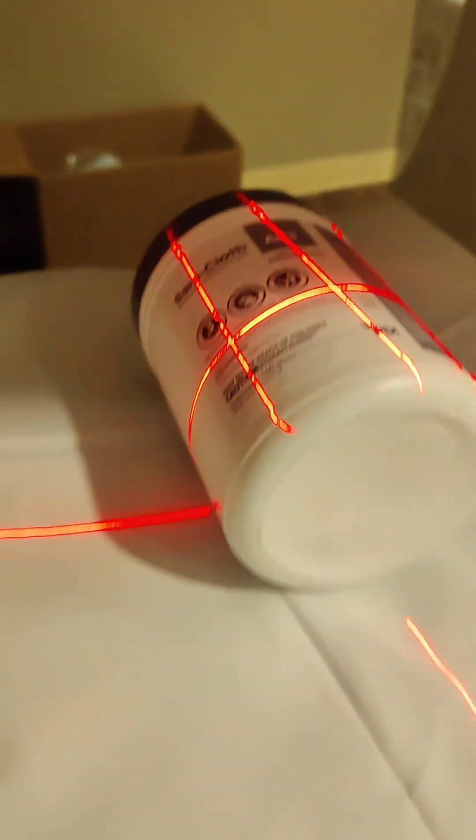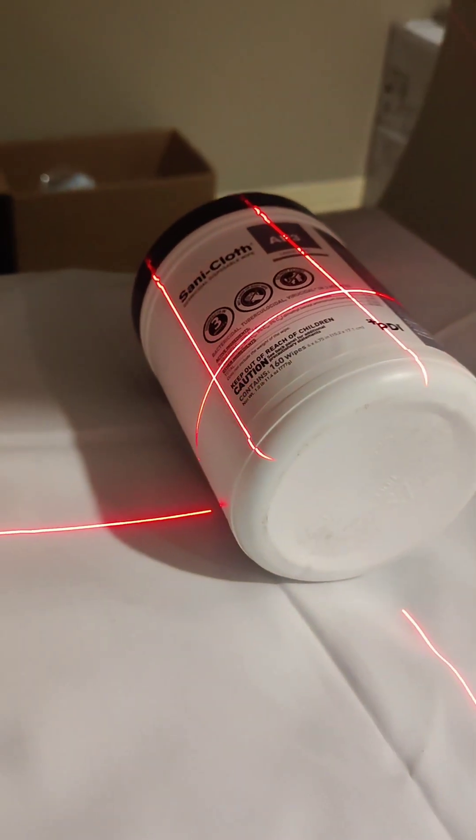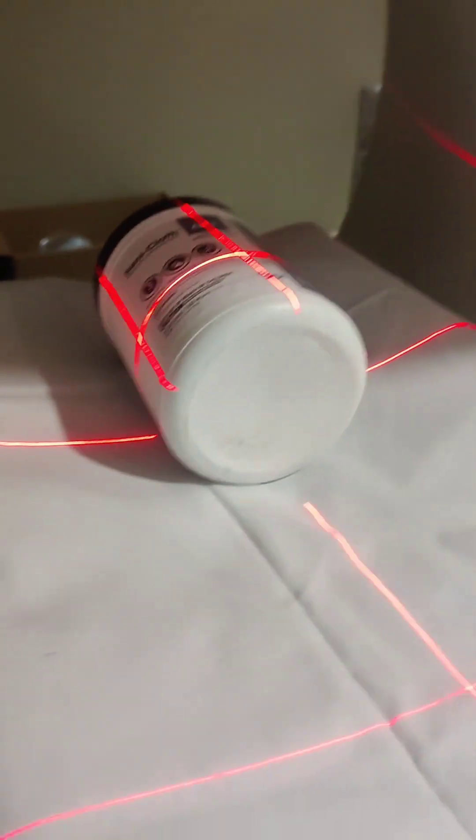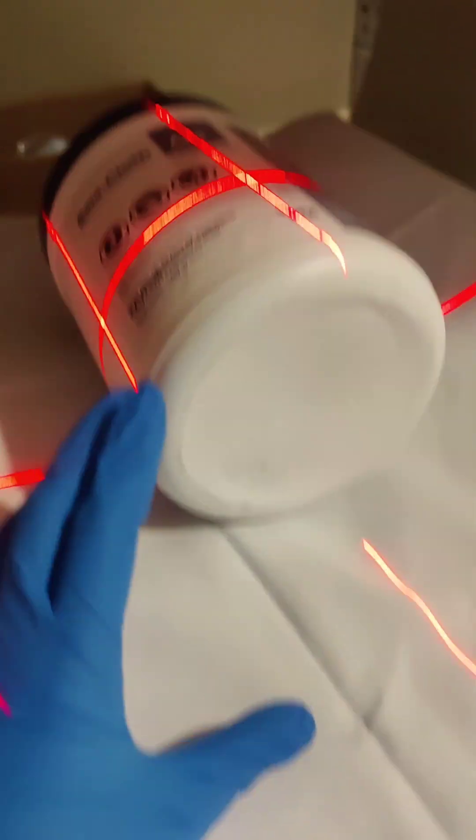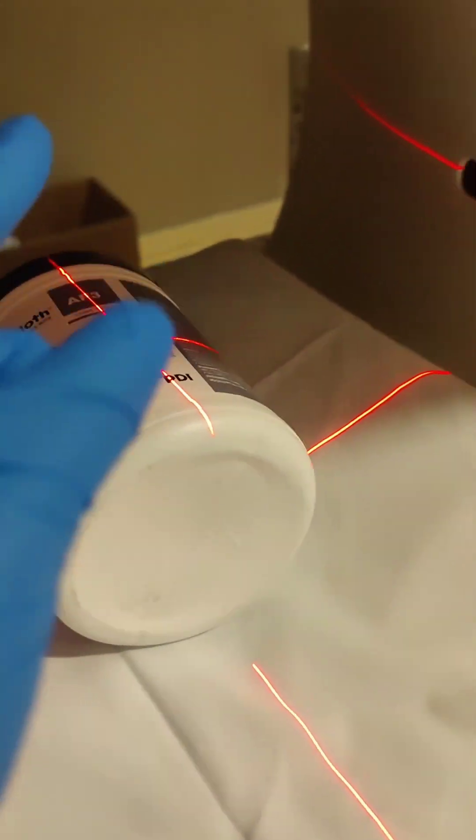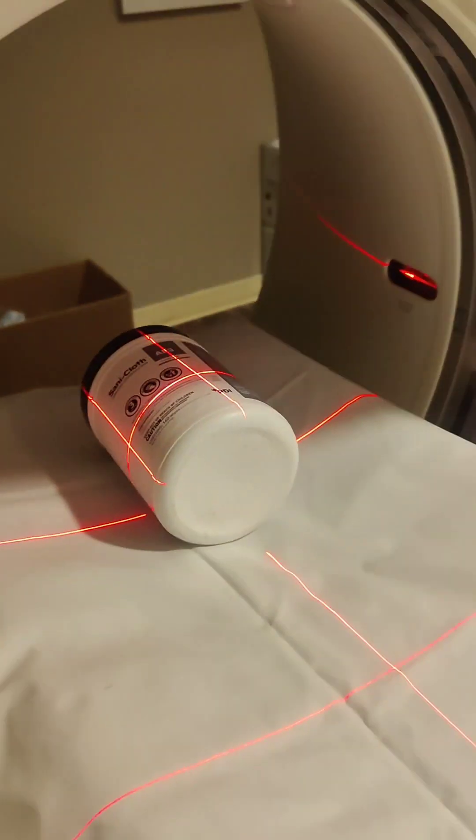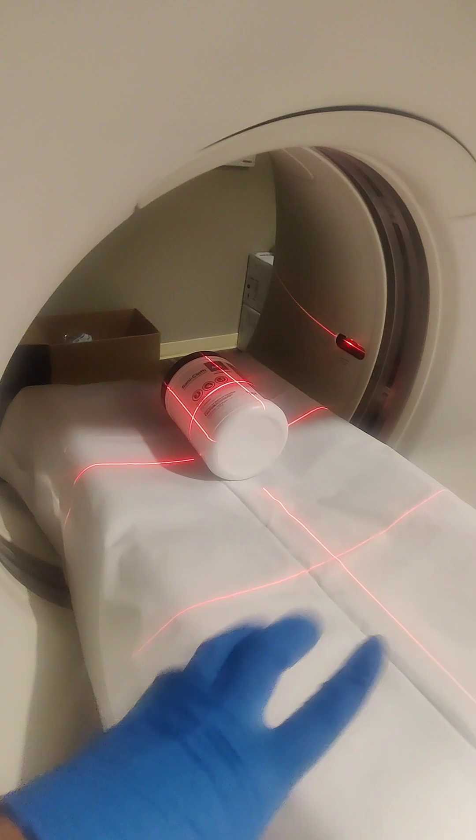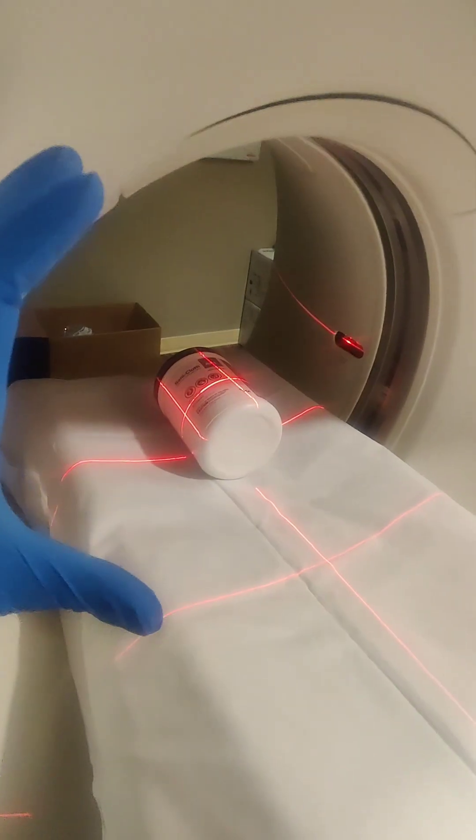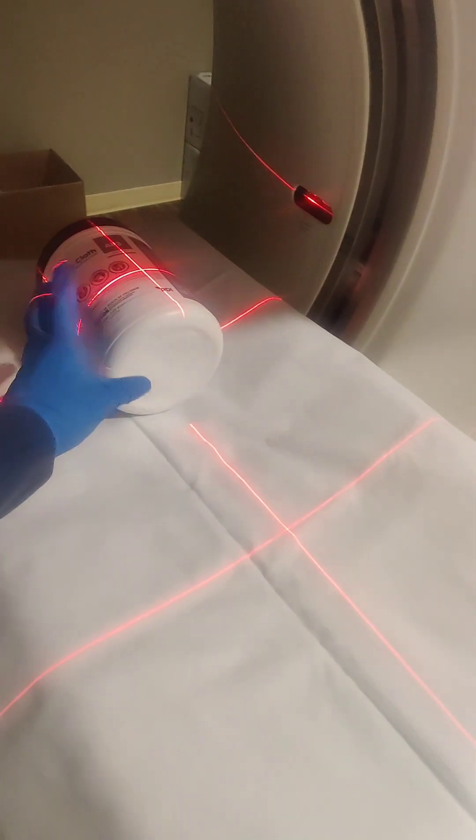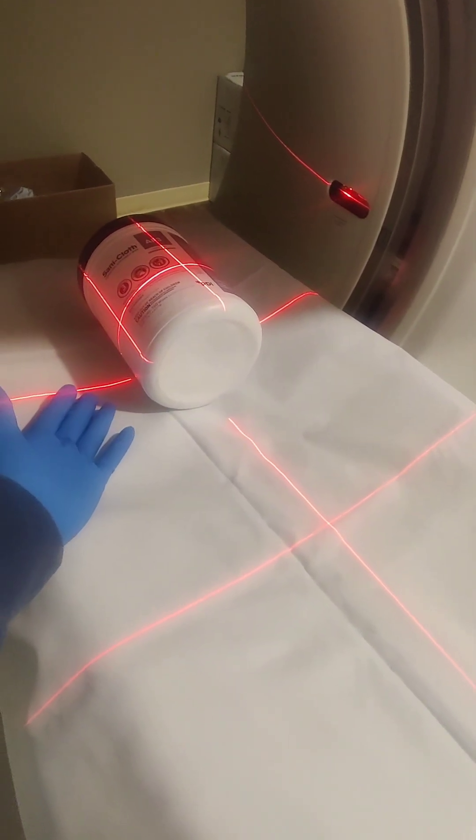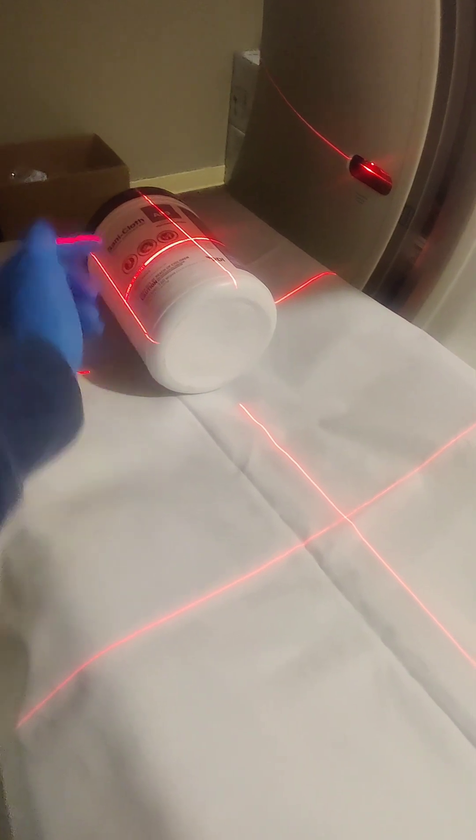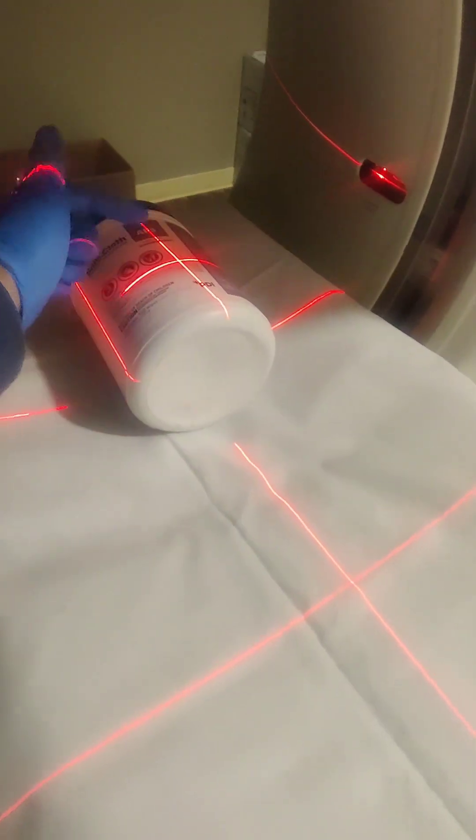This line right here should be centered because anything that you're scanning, you want it isocentric. Meaning you want it in the center of this CT hole. You want it in the center, whether it's a chest, whether it's your ankle, the wrist. You want the target to always be here.